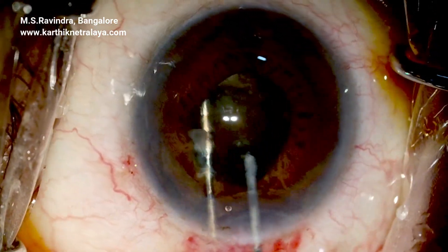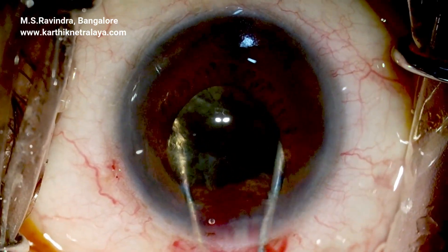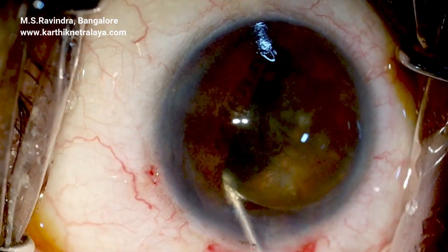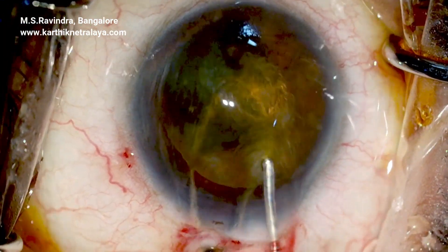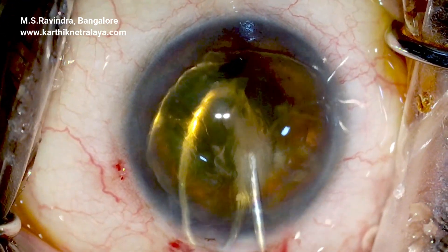Using the 2.8 mm keratome, the nucleus is rotated within the capsular bag after gentle hydrodissection, then prolapsed into the anterior chamber by rotation with two instruments: a 25-gauge cannula and a dialer.